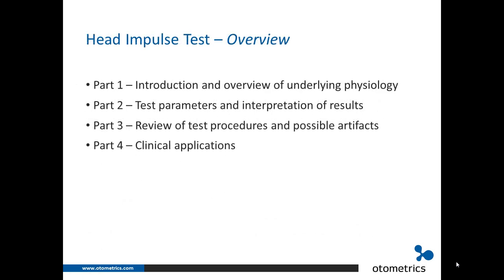This concludes the second part of the video presentations on vHIT. The next part will concentrate on how to perform the test in order to obtain valid results and how to identify and avoid common artifacts.